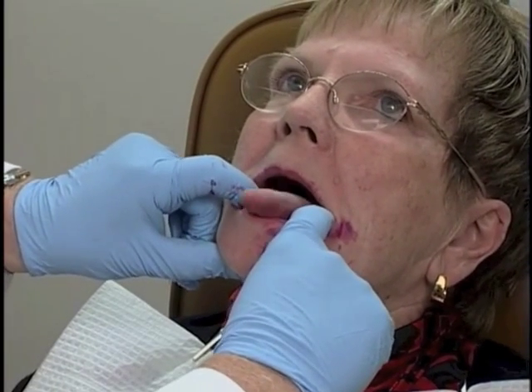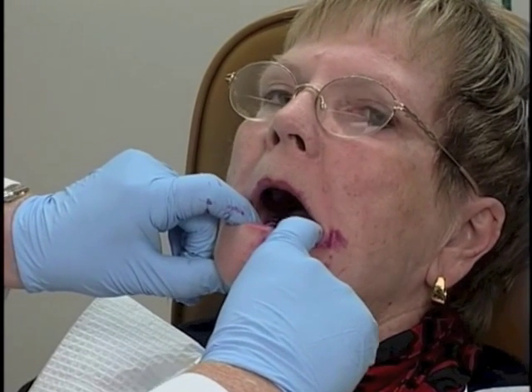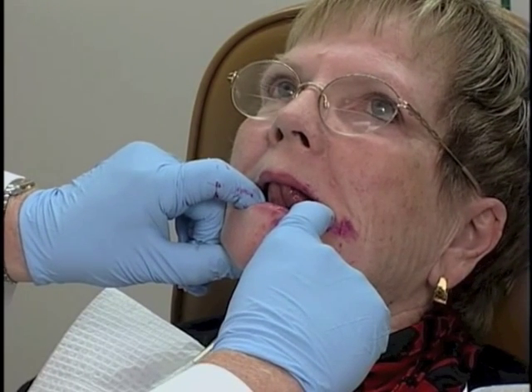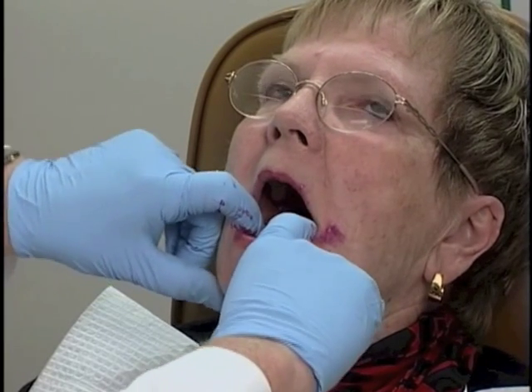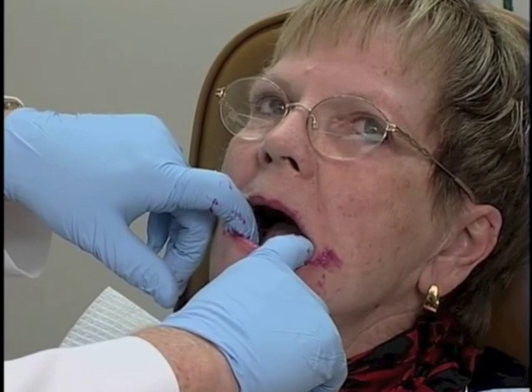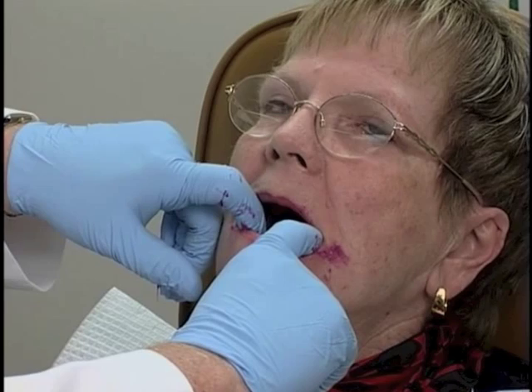Tip of the tongue straight out, right cheek, left cheek. Now put the tip of the tongue where your upper two front teeth should be and press with the base of your tongue. That's it, good. Relax now. I think the material is now set sufficiently to not go through any more border molding procedures. It's just a matter of allowing the material to totally set now.